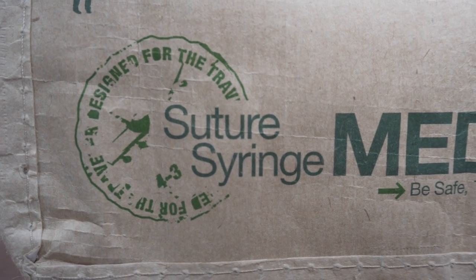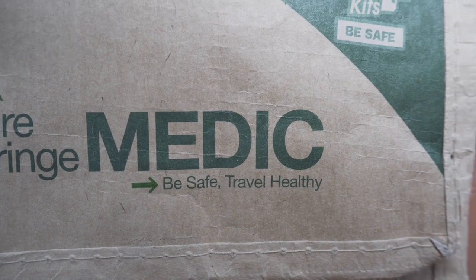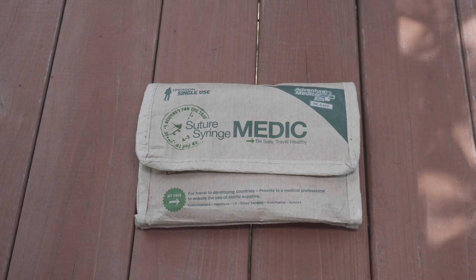Hey guys, it's Cody with Option Gray. I want to take a couple of minutes to look at the Suture Syringe Medic by Adventure Medical Kits.